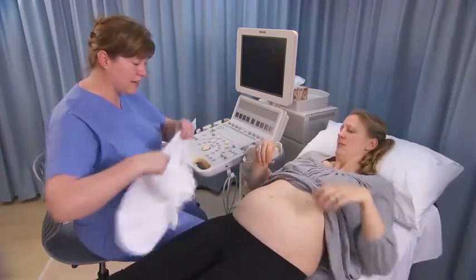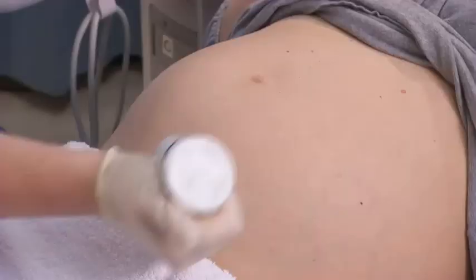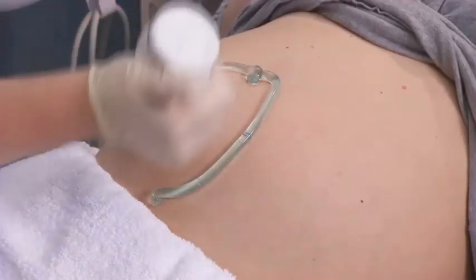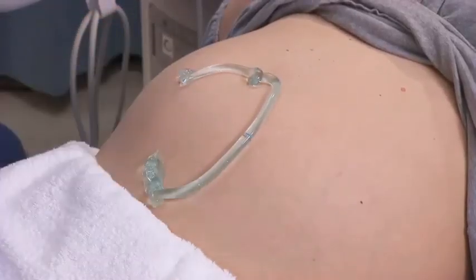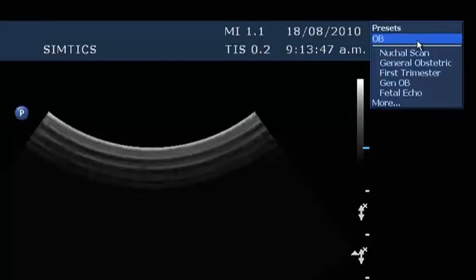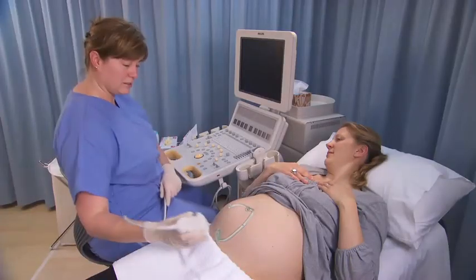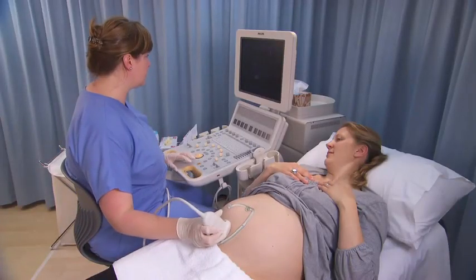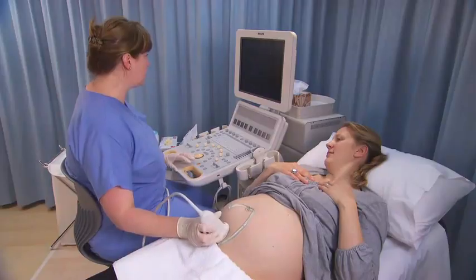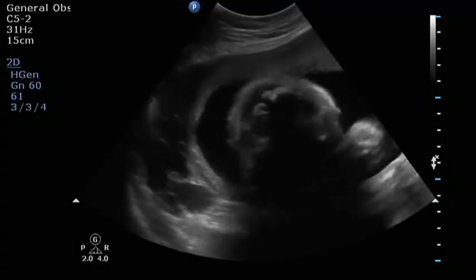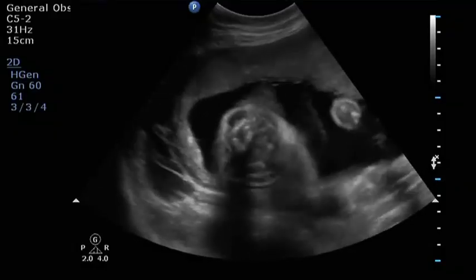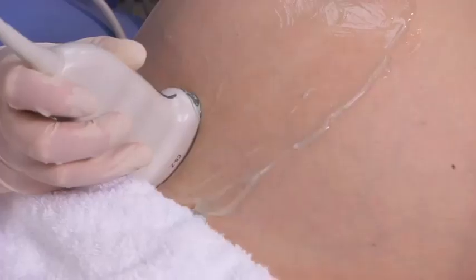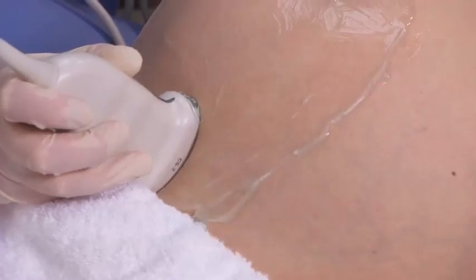Expose the lower abdomen and apply gel. Confirm the correct transducer preset. Place the transducer on the lower abdomen and perform a survey scan of the pelvis and fetus, starting in the longitudinal plane.